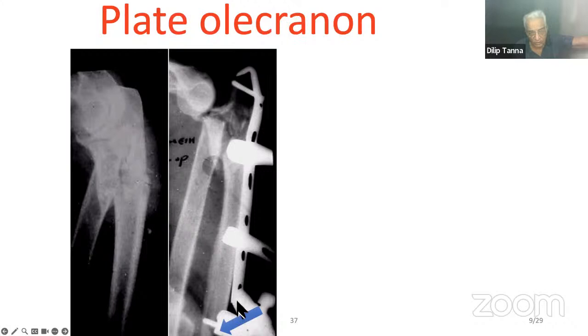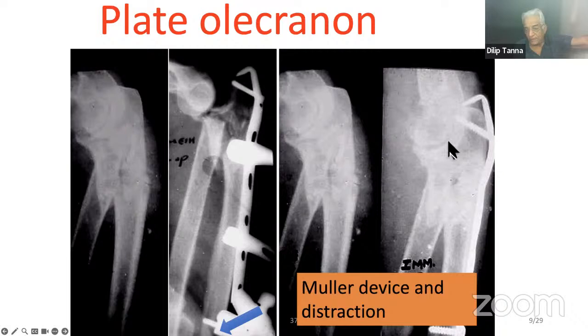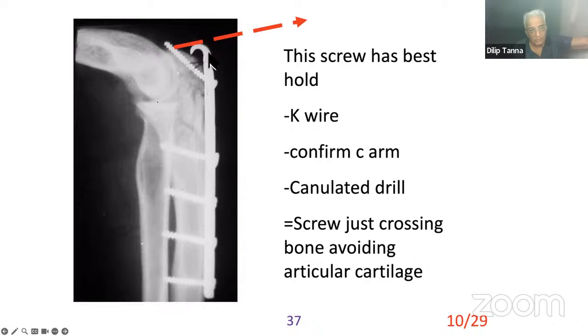I'm doing the compression, first the distraction, then holding this fragment, and then the compression. Distraction, and then the compression, and the whole fracture is fixed up. And this is the one which heals up. This is the design somebody made, which is not good enough. But even if you put that, you can put this one screw, which is going to hold well.